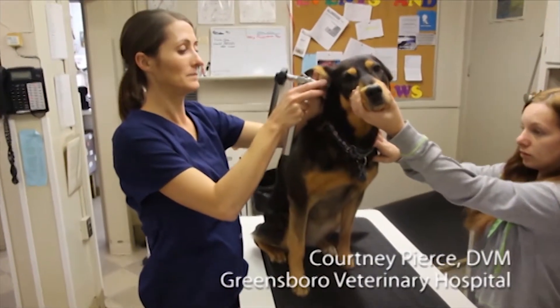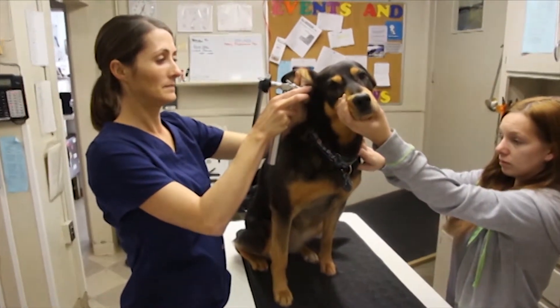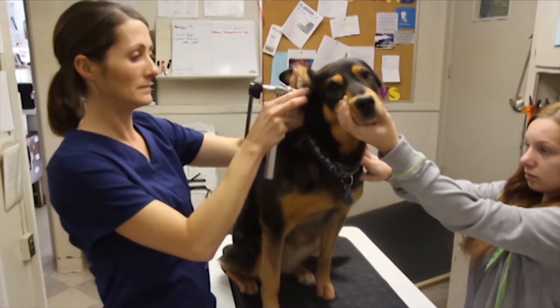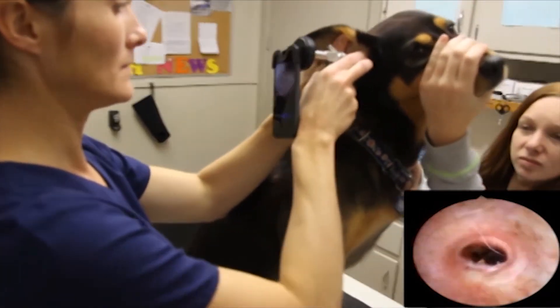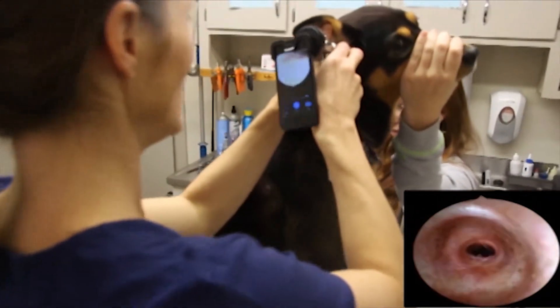Many veterinarians feel that they get a better, safer exam using the VideoScope. No longer is your face up against a dog's ear that might already be inflamed. With this scope, you can view the tympanic membrane.